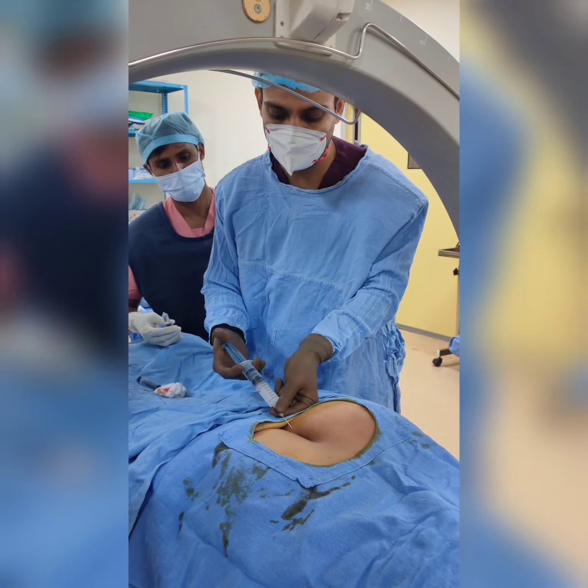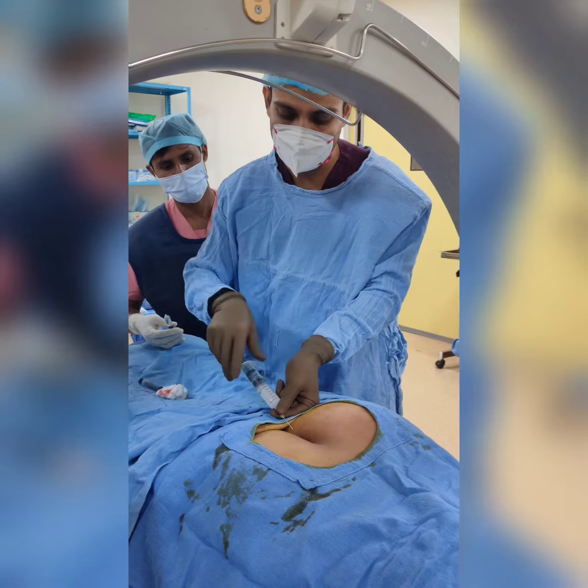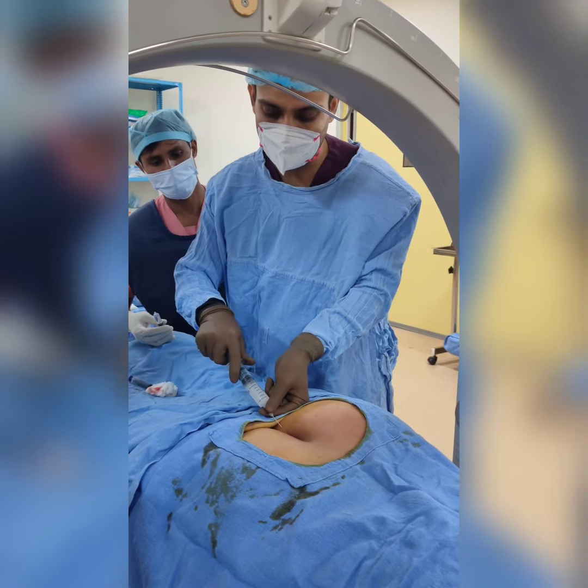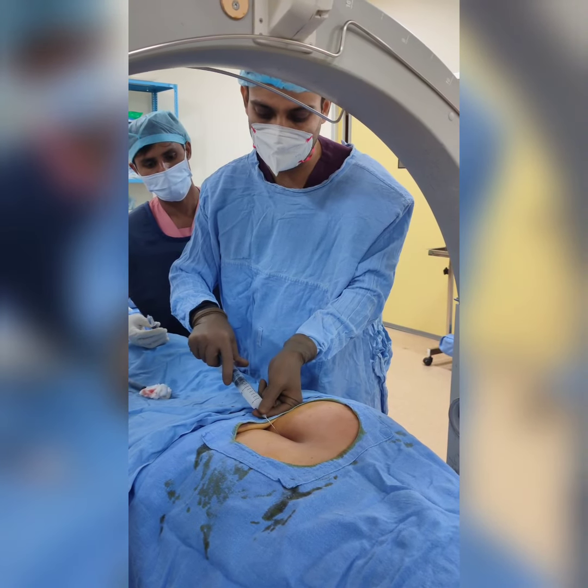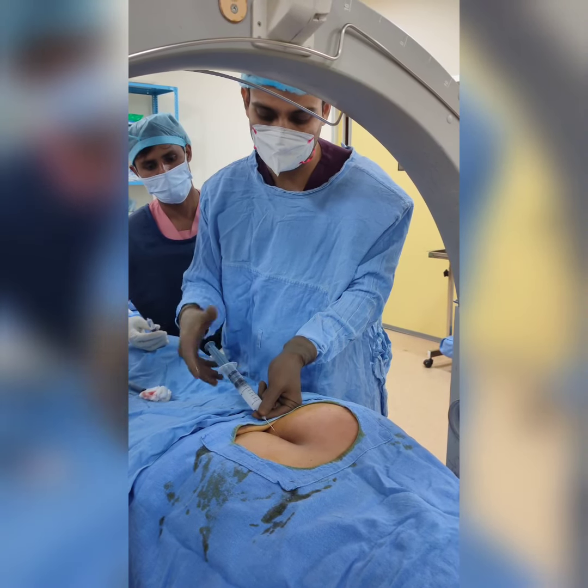You can see it is going freely now, slowly and freely. Now I am aspirating — nothing is coming out.